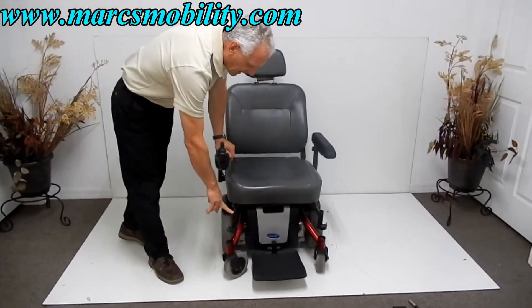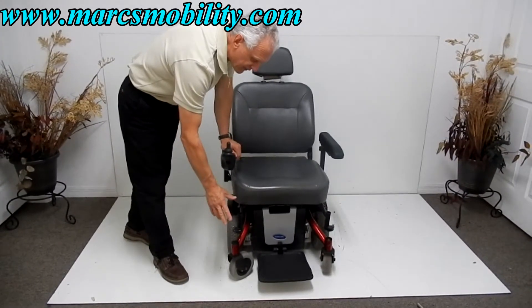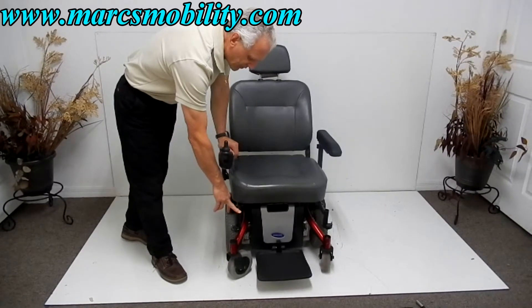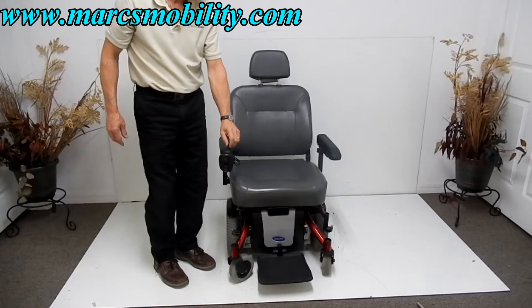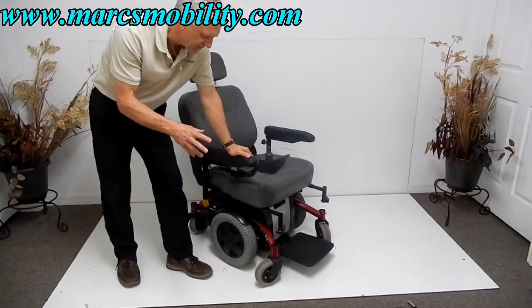You have leg pegs for individual legs — if you need individual leg pegs for this chair, we do have them. This chair will go about six miles an hour outside, as you'll see when I drive it outside.